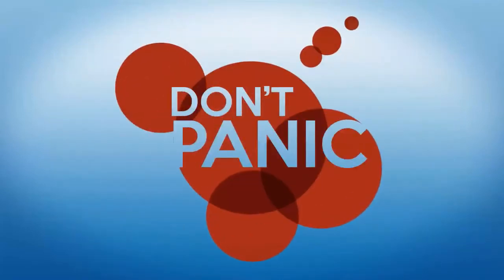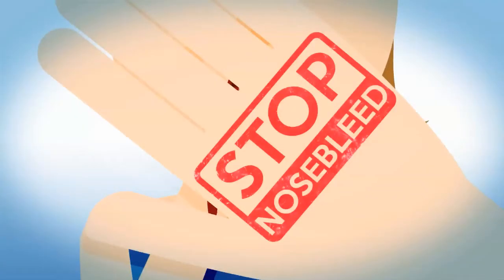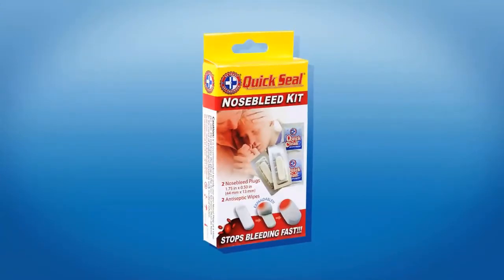When nosebleed occurs, don't panic. We've got your nosebleed covered. With QuickSeal Nosebleed Kit, you can rest your worries behind.